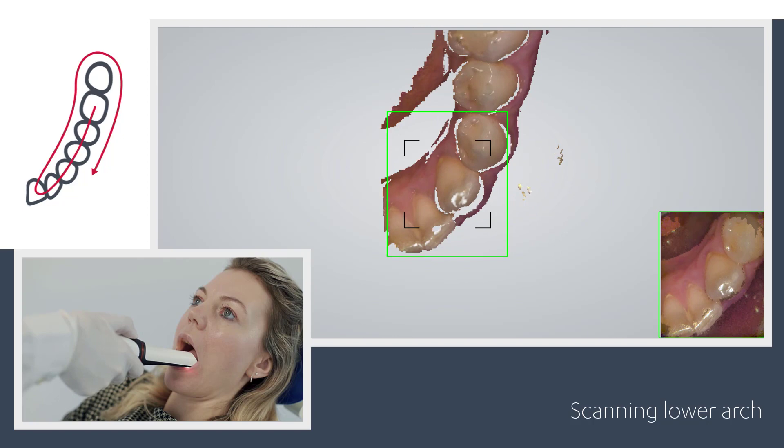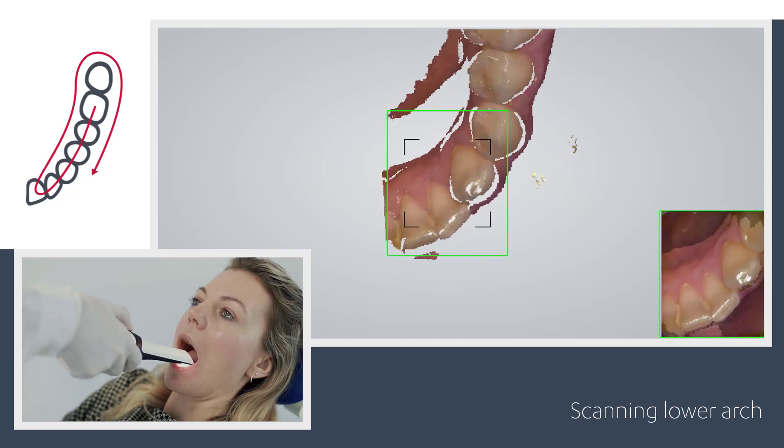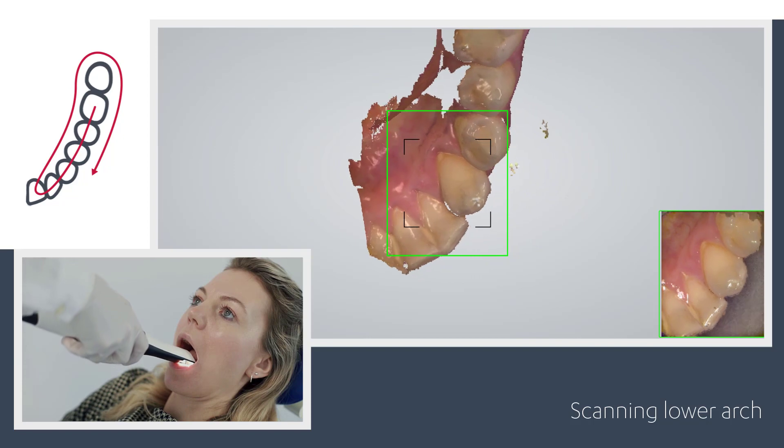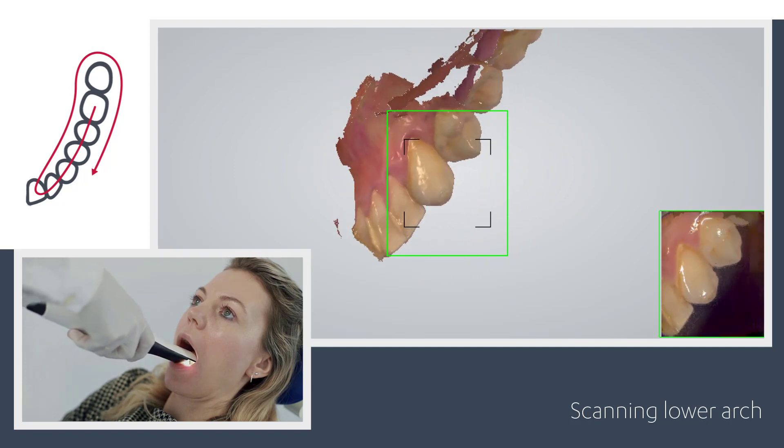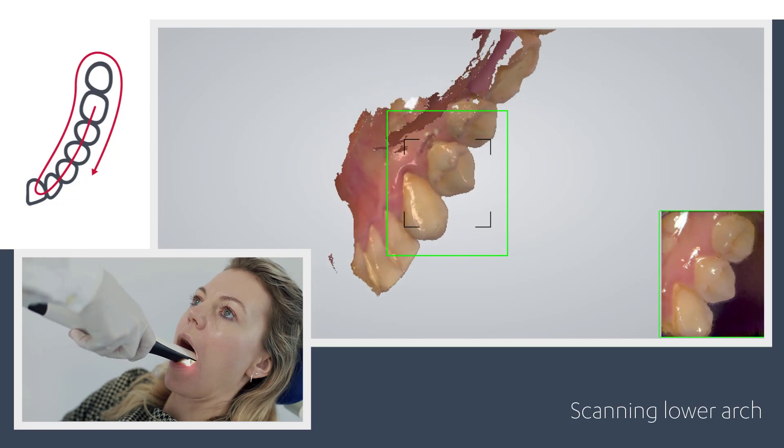When you reach the canine, turn slowly lingual, taking care first of areas where soft tissue may interfere with the scan. Roll the scanner 60 to 90 degrees to the lingual side. Use the tip to keep the tongue away, and go along the lingual surface until you reach the last molar.